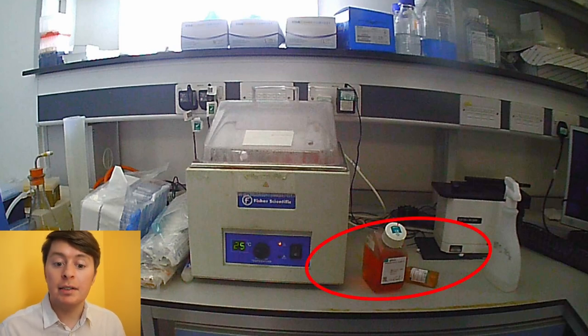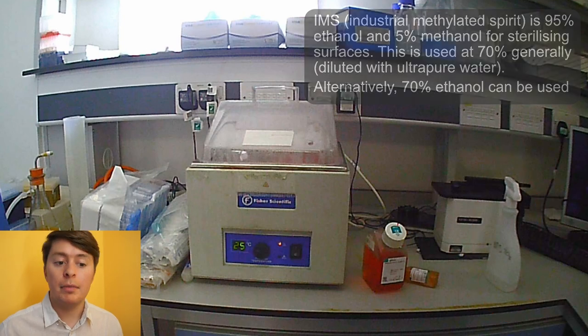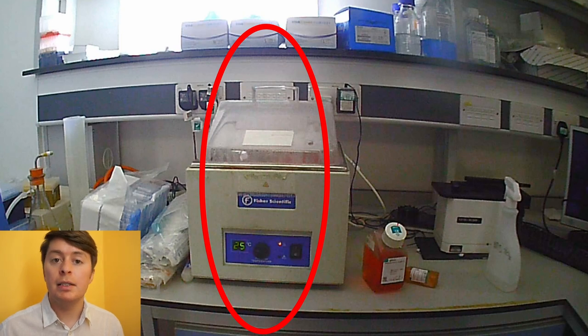So what we see here is our media on the right hand side, and far right, IMS, which is just to spray everything, make sure everything's sterilized, get rid of any bacteria. And in the middle, we have our water bath. Our water bath here is important so that, as I mentioned, we can warm up that fetal bovine serum and our antibiotics that we've frozen down into smaller aliquots or just ordered in smaller batches so that we can add them straight into our media. Because of the throughput we were doing on this project, we decided to go for smaller quantities because we would culture up a lot and then process.